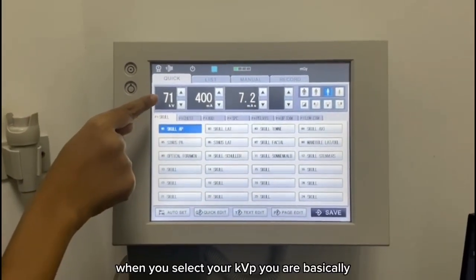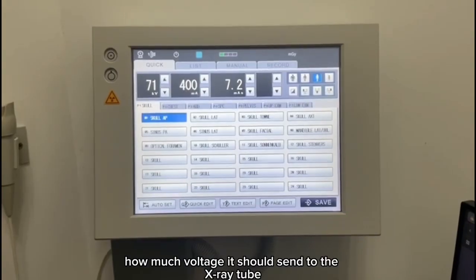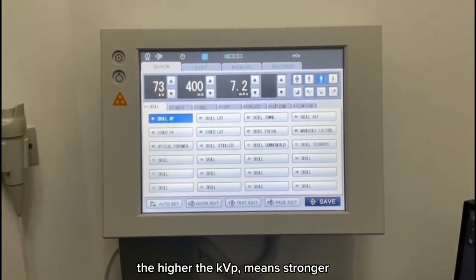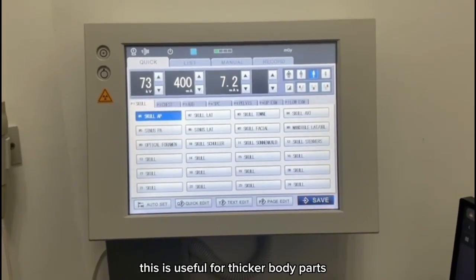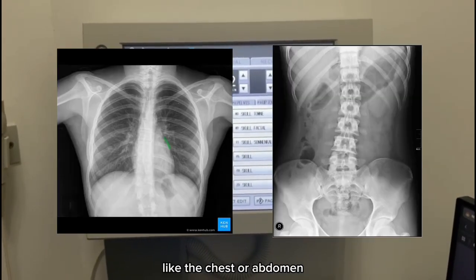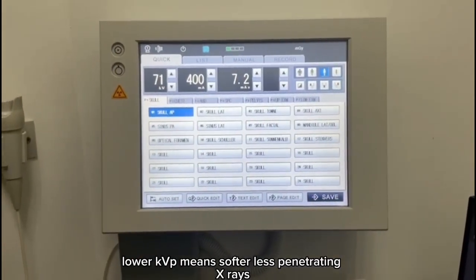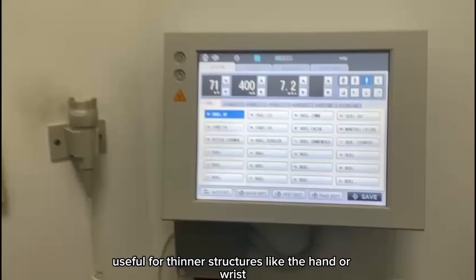When you select your KVP, you are basically telling the generator how much voltage it should send to the X-ray tube. The higher the KVP, the stronger, more penetrating the X-ray. This is useful for thicker body parts like the chest or abdomen. Lower KVP means softer, less penetrating X-rays, useful for thinner structures like the hand or wrist.